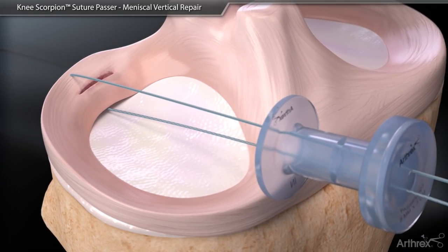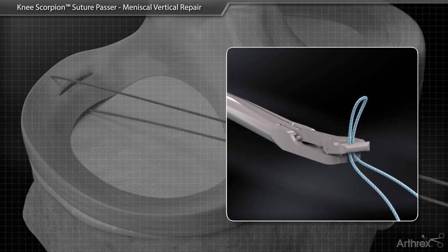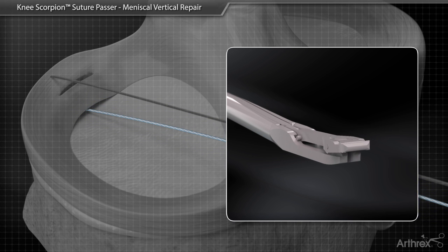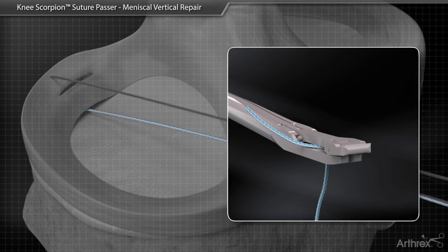Remove the suture from the Knee Scorpion by closing the jaw and advancing the needle. While the needle is deployed, remove the suture. Load the bottom jaw of the Knee Scorpion with the opposite end of the suture.